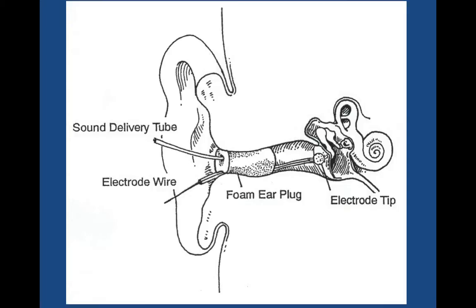And I don't measure, in fact, we have our impedance meter turned off. I don't measure impedance with this. It's going to be relatively high. It's a very small surface area. And when you measure impedance, you actually drive current through the electrodes. And I did that a few years ago, and the patients were feeling it. So I stopped doing that. And I've never really had any recourse or reason to be real concerned about impedance here.